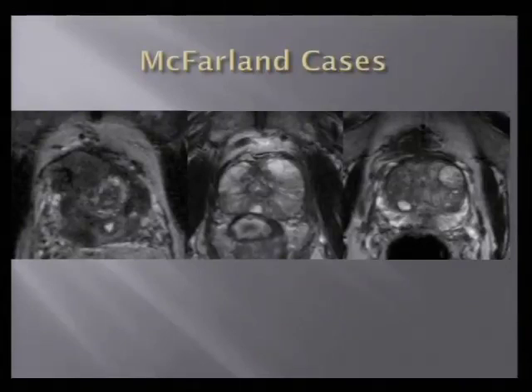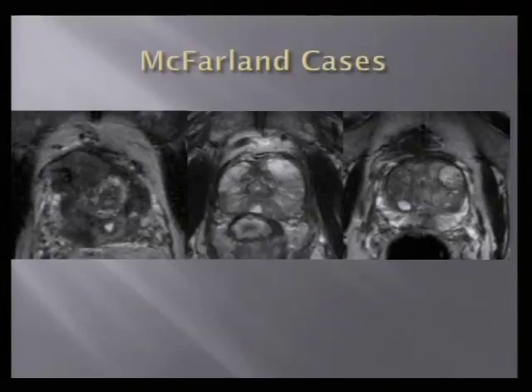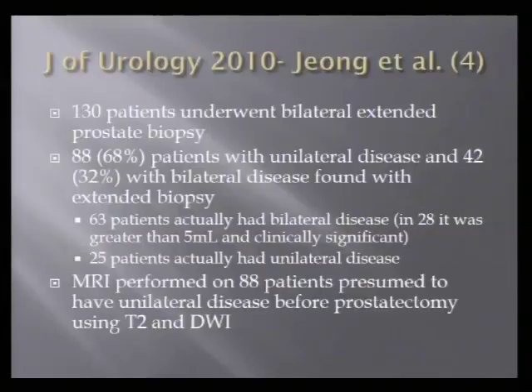And the reason I'm showing this case is, and I'll get into this a little bit later, the importance of prostate MRI is this: you want to be specific. We don't want to be calling this subtle extracapsular extension that might not be there, might be there, and preclude a person from a prostatectomy, based on very subtle abnormalities. This is what, in my opinion, we should be looking for: something that's obvious that could change a patient's management. And in this case, I think it probably will.